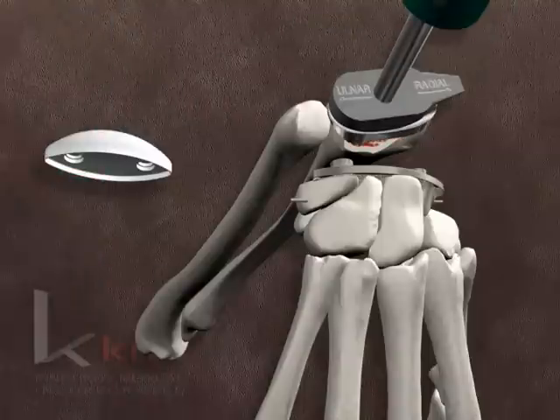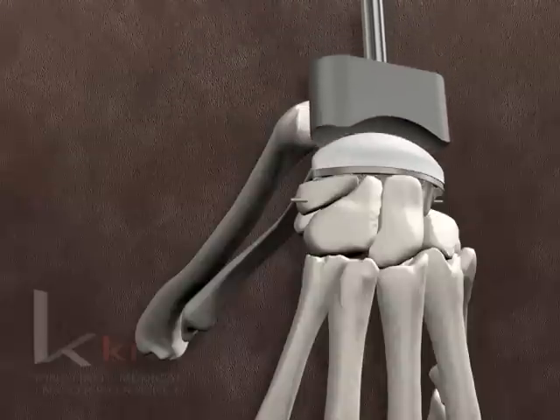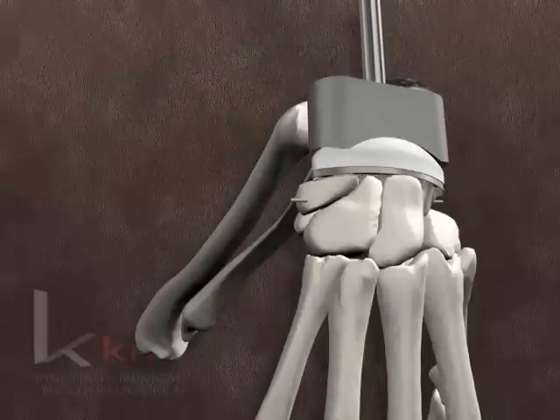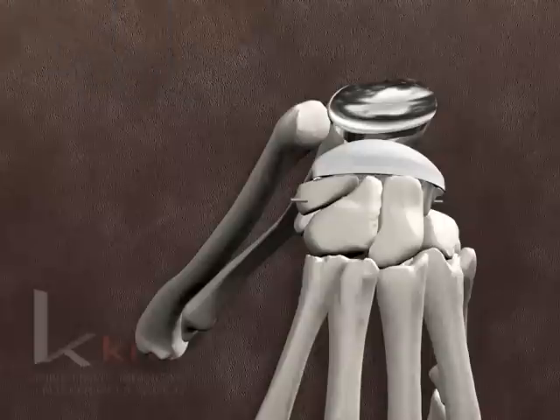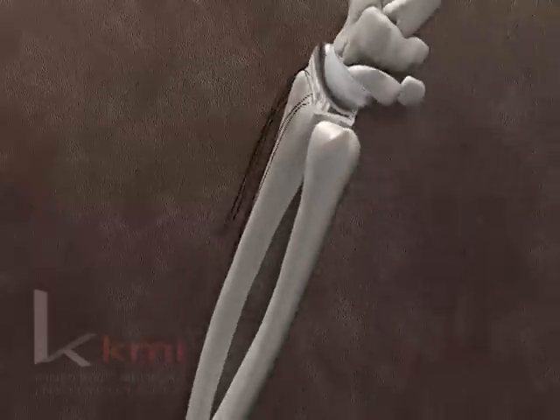Using the radial impactor, the true radial component is driven into the metaphysis with care to maintain proper alignment. The trial polyethylene is applied to confirm the proper size. Using the impactor, the true polyethylene component is snapped onto the plate with firm mallet taps. Confirm the polyethylene component is completely engaged onto the carpal plate. Remove any remaining K-wires from the carpus.